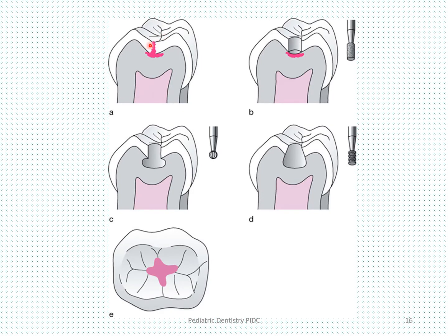So when you are trying to excavate the caries, the most important part is to get the dento-enamel junction free first, and the margins of your preparation caries free first. Okay, so you see here the margins in this particular is now caries free. All right, so once you get this margin caries free and you reach the dento-enamel junction, then you start excavating the caries in the dentine.